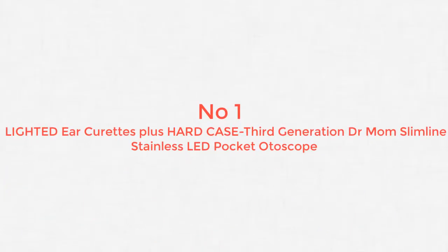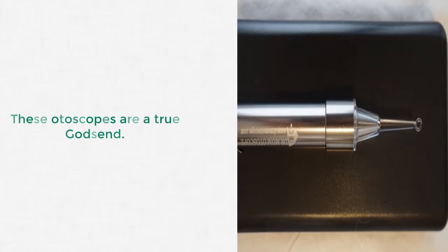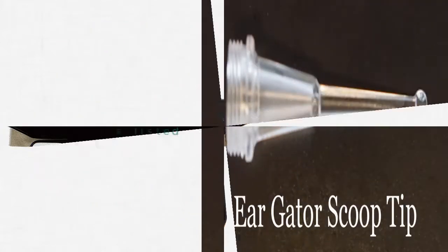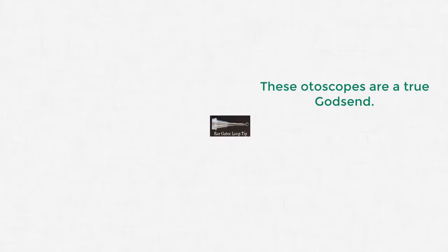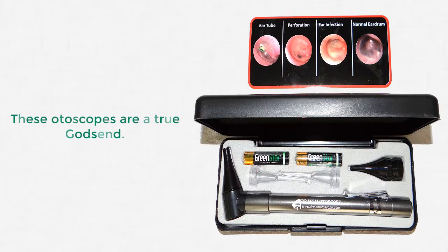Number 1: Lighted Ear Curets Plus Hard Case — 3rd Generation Dr. Mom Slimline Stainless LED Pocket Otoscope. It includes a variety of accessory gear: the Ear Gator Loop Tip, Ear Gator Scoop Tip, 2X Ear Gator Lighted Ear Curets, Removable Otoscope Head, Pocket Clip, Plastic Storage Case, and the Otoscope itself. The most frequently mentioned use case in product reviews is kids with ear infections.